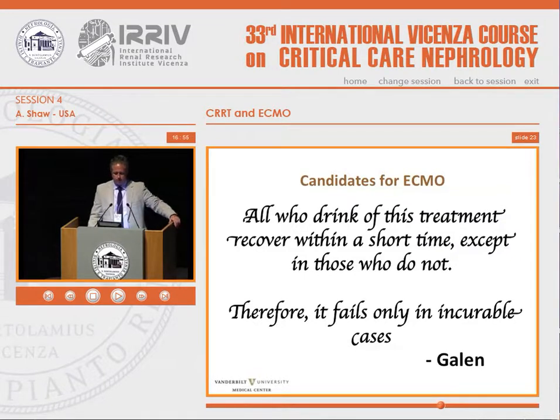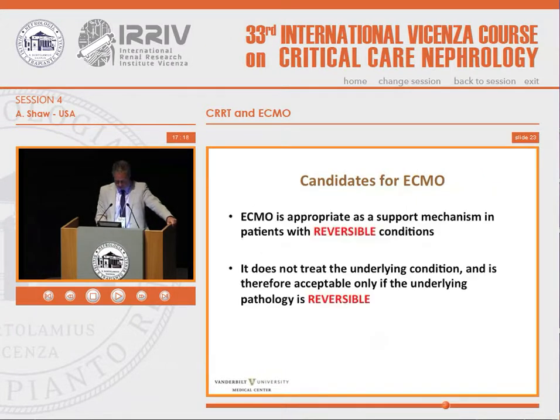Now, who to give ECMO to? I love this quote. This is from Galen, apparently, and it's particularly relevant for ECMO. All who drink of this treatment recover within a short time, except in those who do not. So the conclusion must be that it fails only in cases that are incurable. And if you get into the ECMO business, you will see people who will tell you this sort of thing. The fundamental concept is only do this if the underlying condition is reversible.